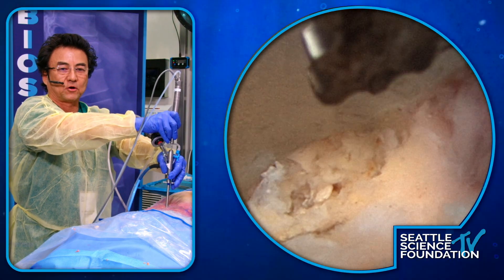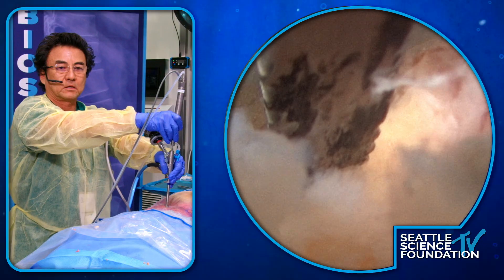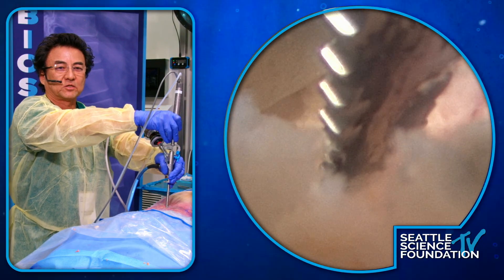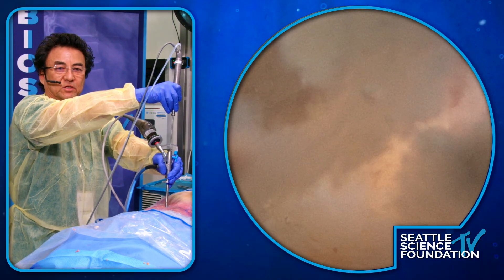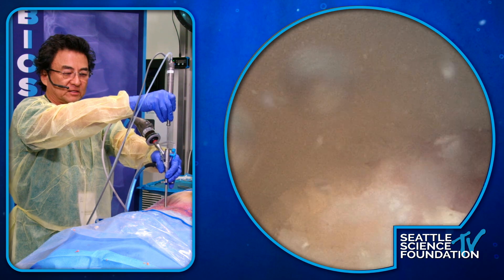Do you just put it on max speed, or do you ever change the settings? I always go max, but I'm sure there are settings. There's only one setting I've ever used. Usually there's much less snow — I think we're having some flow problems.